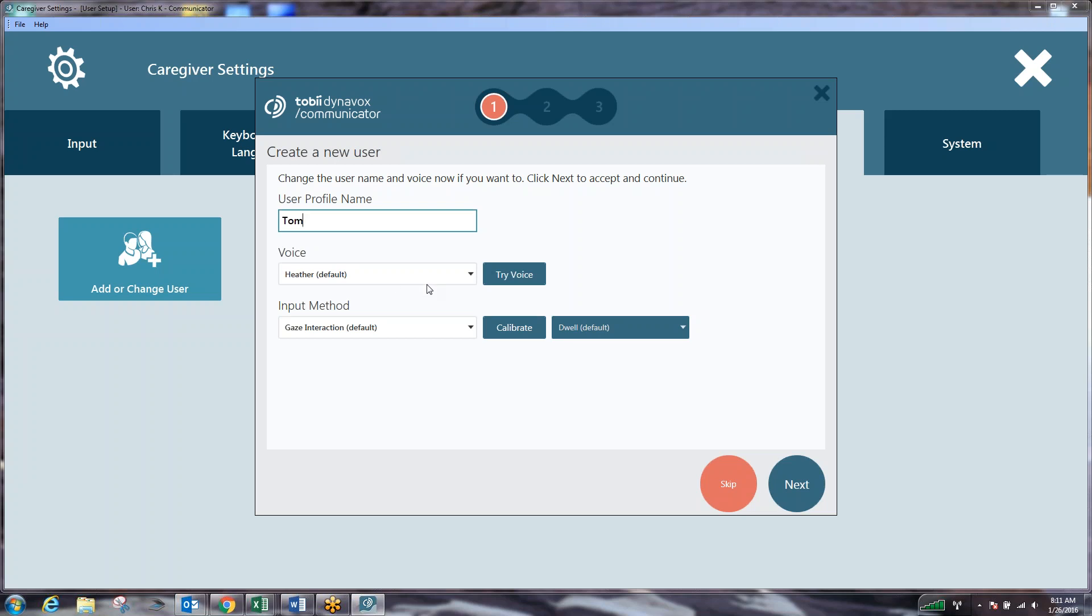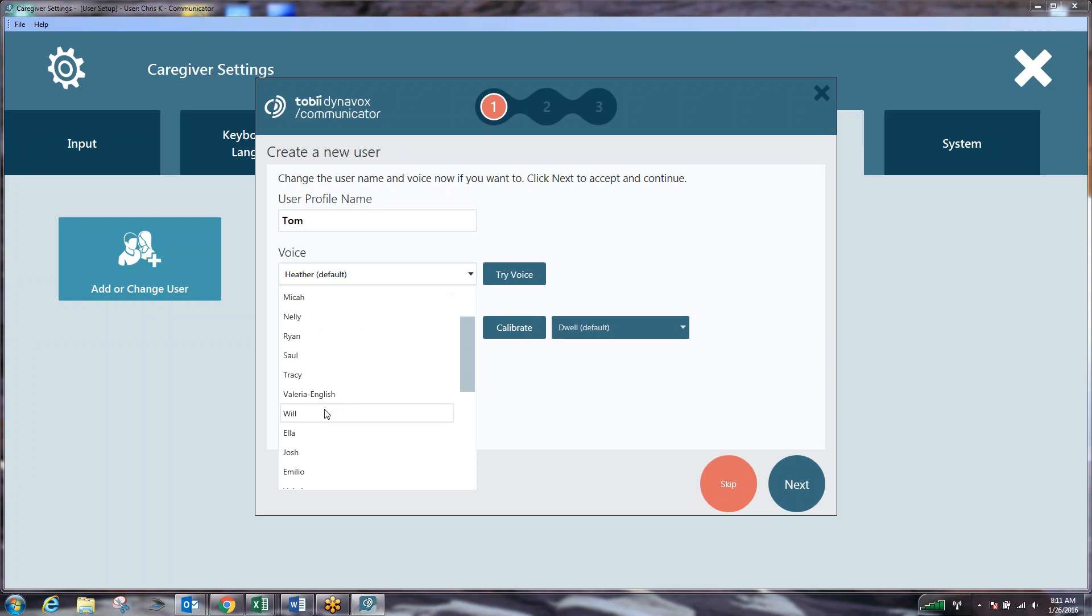We can then verify or select different voices. I'm just going to select a gentleman's voice.